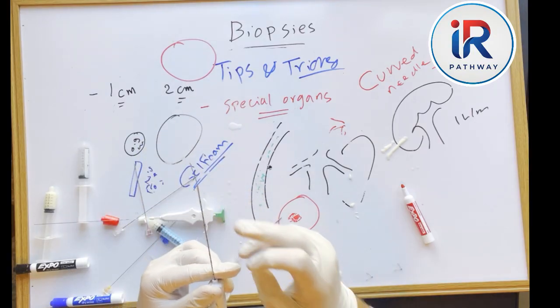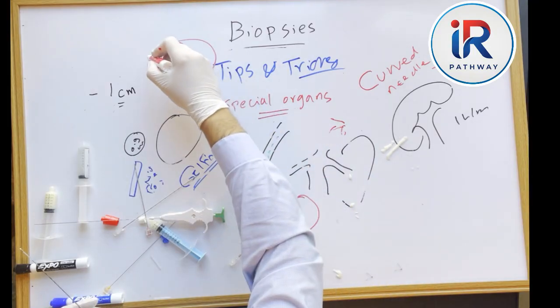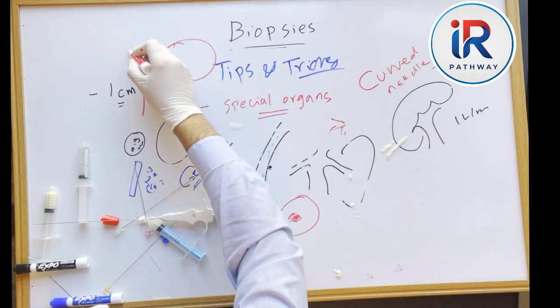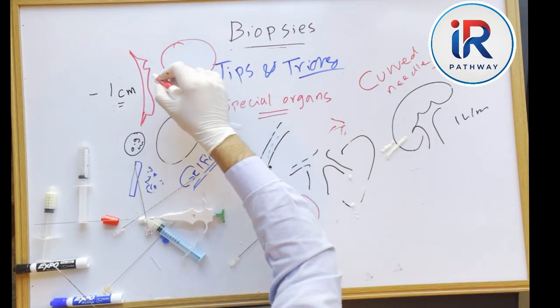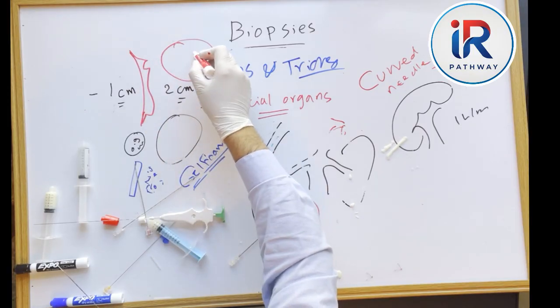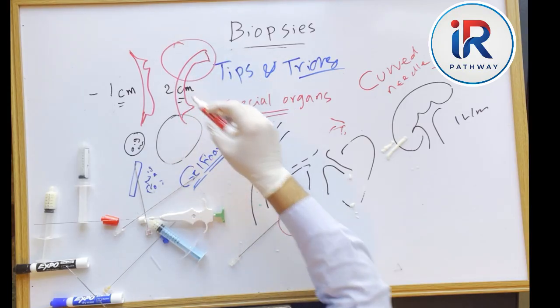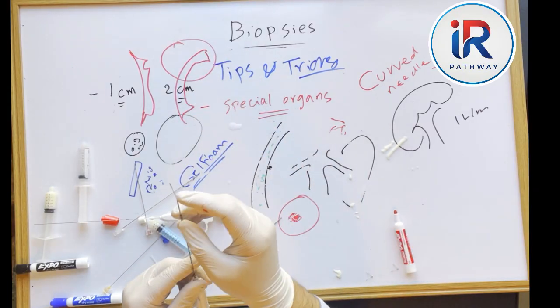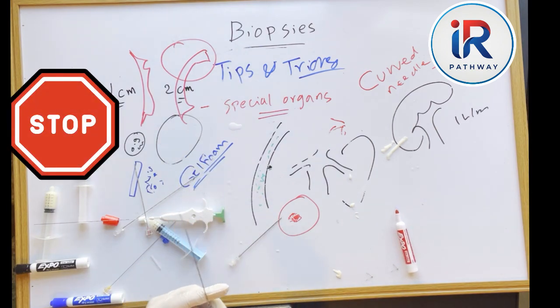And it's very important to always ensure the curve is directed outward. I mean the needle should always be shaped like this. The notch should face outward, not inward, because otherwise the spring mechanism may not function properly. And if you overbend the curve beyond the acceptable limits, you may damage the needle's mechanism.